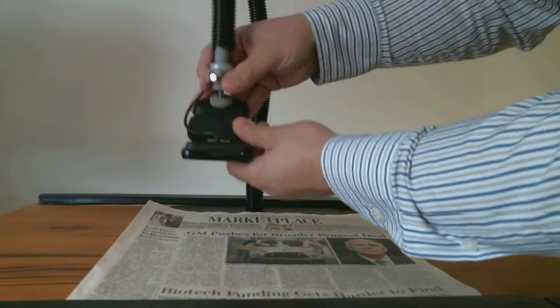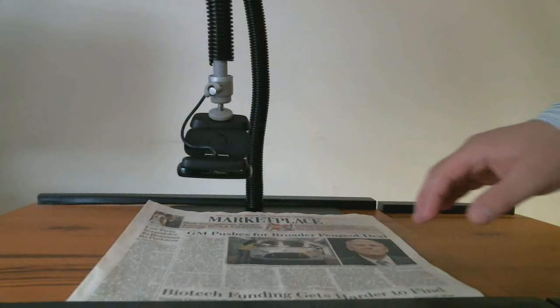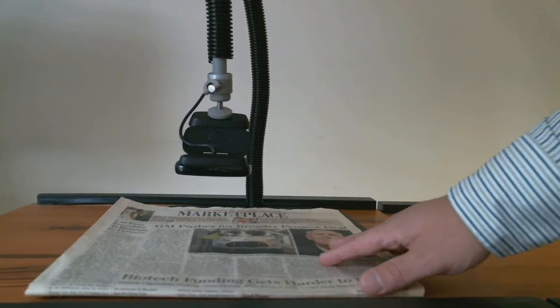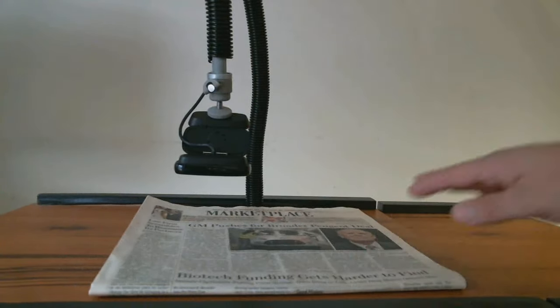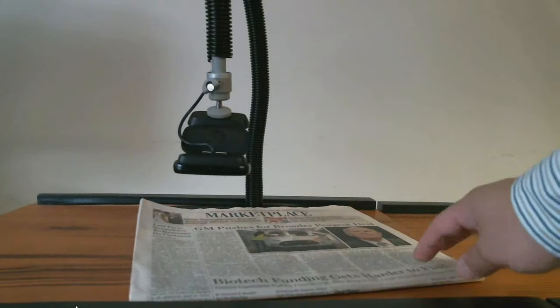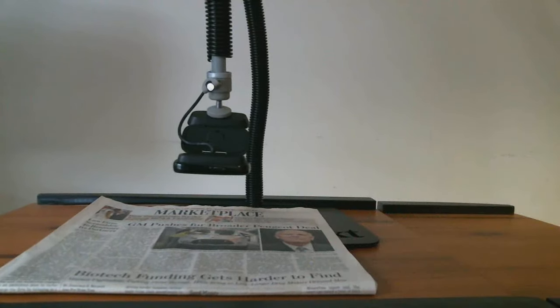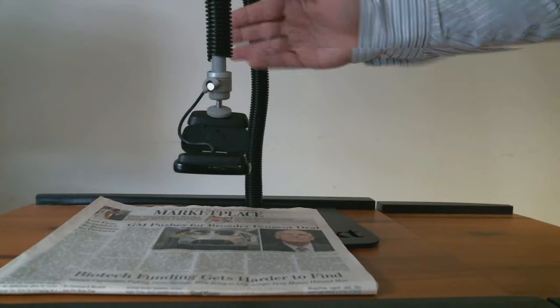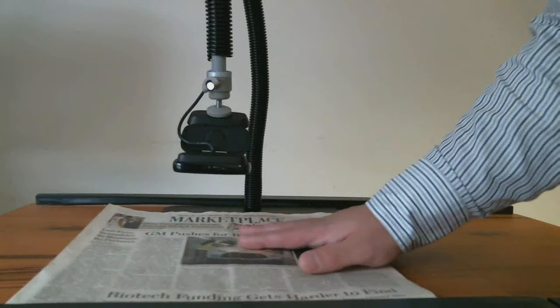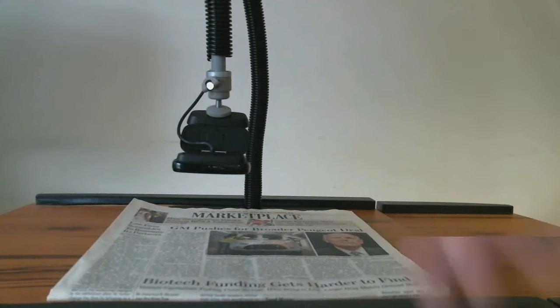So what you want to do is have the camera positioned about 4 to 6 inches away from your printed material, no more than that. So you're going to have a very small field of view as to what you're looking at, but all you'll need to do is move the printed material underneath the camera, and it'll work much like a traditional CCTV. A lot of desktop CCTVs have a camera mounted up top. You put your printed material underneath it, and then you have an XY table that you can drag along to move the printed material. The way that you use it is exactly the same as that.